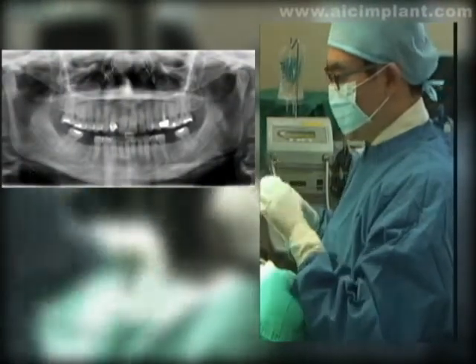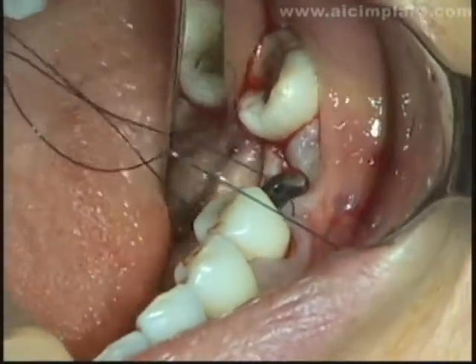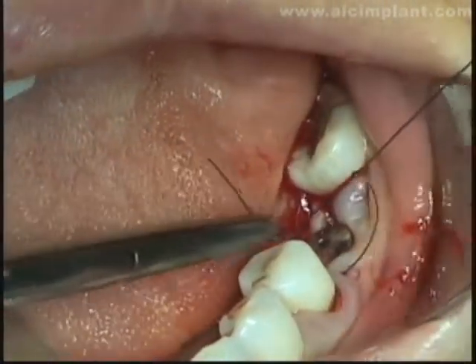Using a healing abutment that is considerably shorter than the gingival height may also cause problems, however. Thus, selecting a healing abutment that is slightly taller than or equal to the gingival height is strongly recommended. Let's now do the suturing.